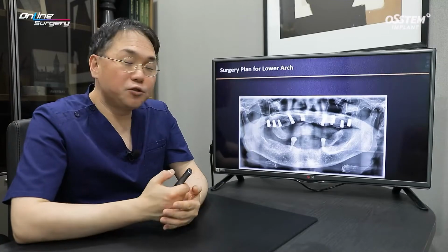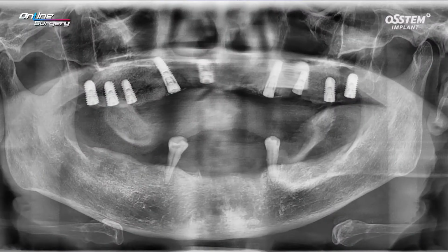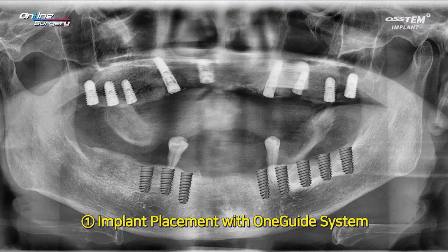Today, this is the surgical plan. Number 34 and 44 were planned for extraction. OneGuide template is going to be used and fixed. 8 implants are going to be placed.